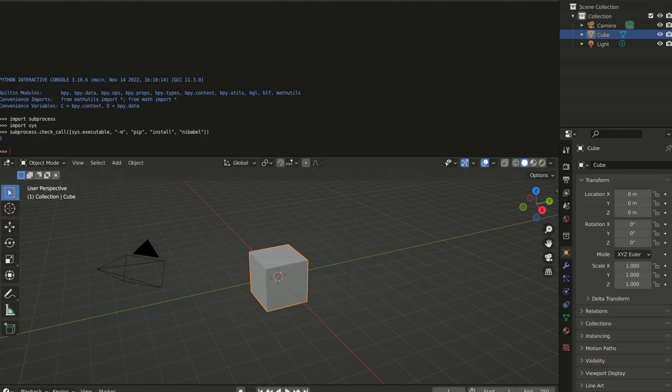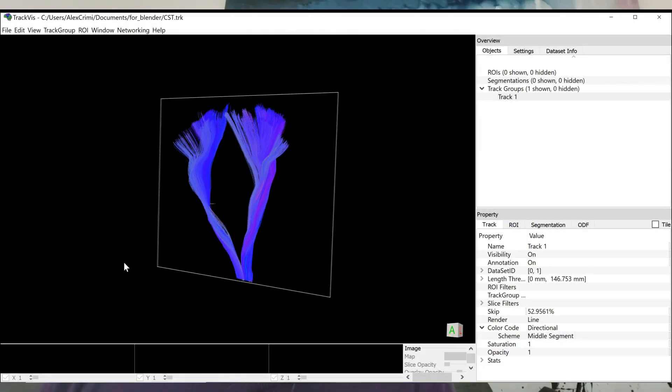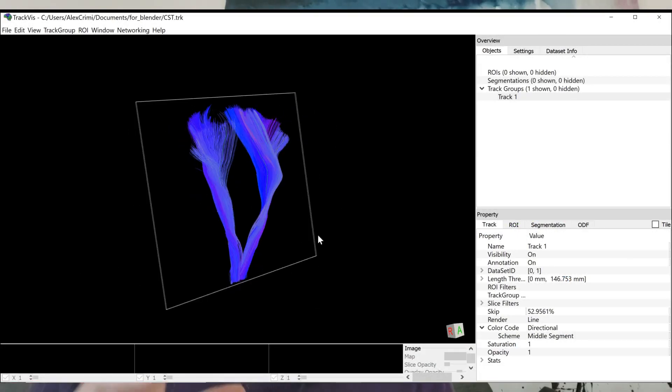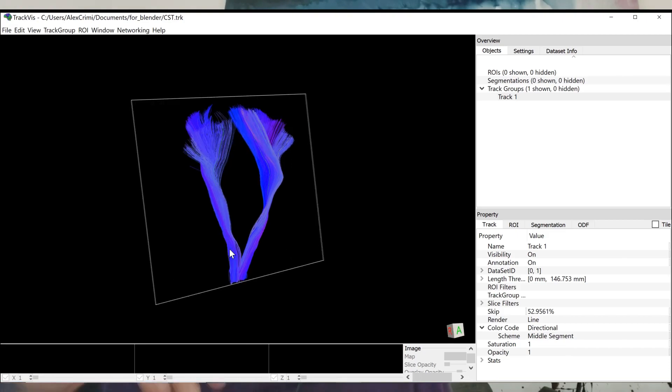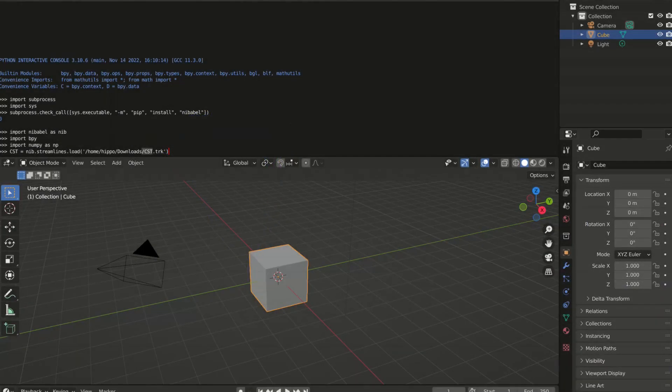Now once you have installed Nibabel not only you can import T1, T2 models of structural brain data but also you can load entire tractography that you have previously computed, either again with MRtrix or with Dipy. I use only a file with some corticospinal tracts since it's more streamline-like. The entire brain will take longer just for this simple example.